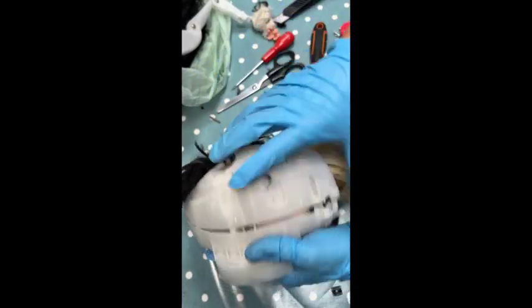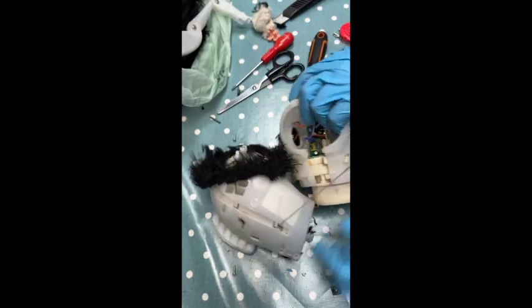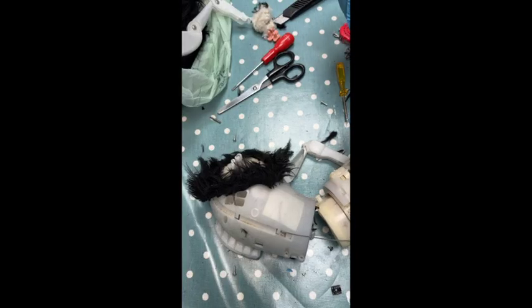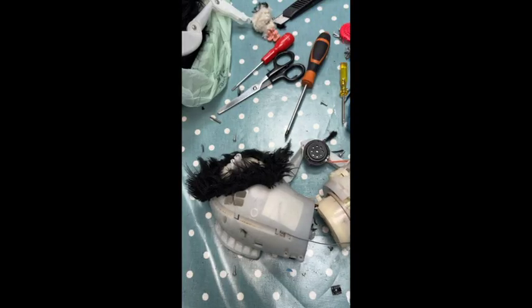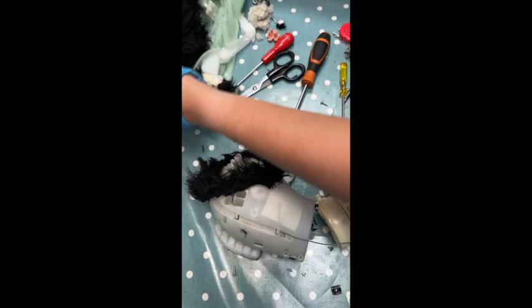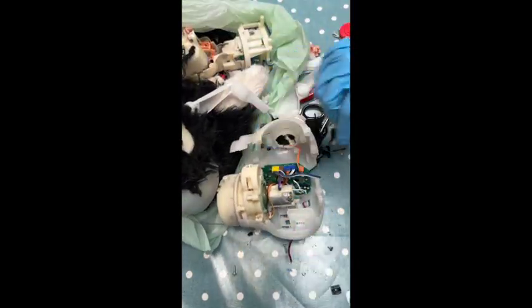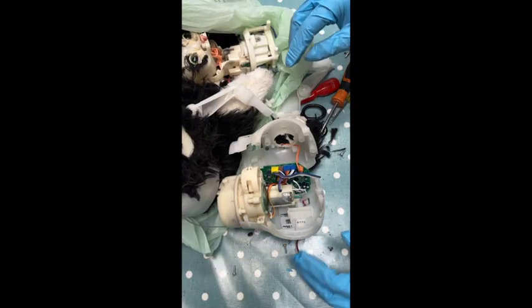And another contact sensor. Interesting, it's inside, not on the surface. So, good magnet that. So yeah, that's the end of the cat. It's all in the bag. And I'm just going to pull out the motors and take that magnet out. But otherwise, going to the bin now.